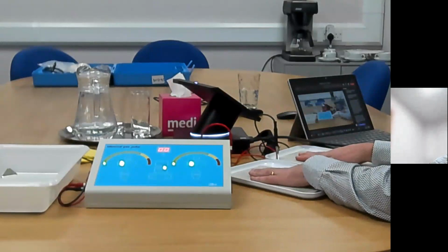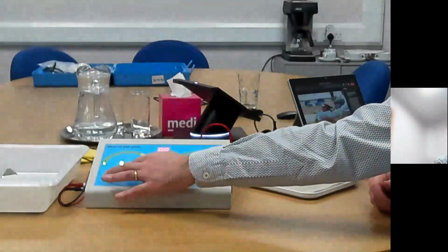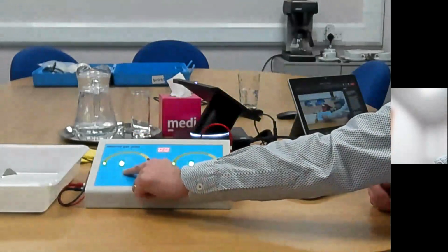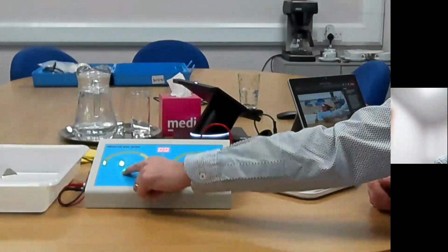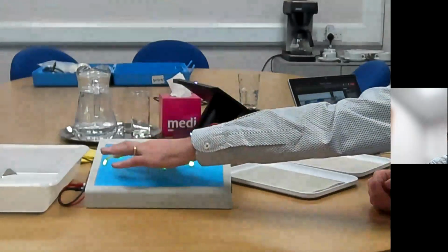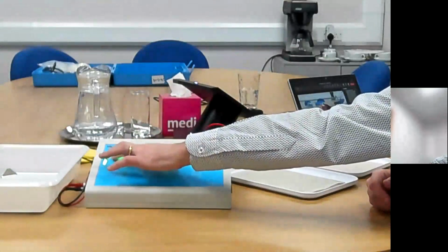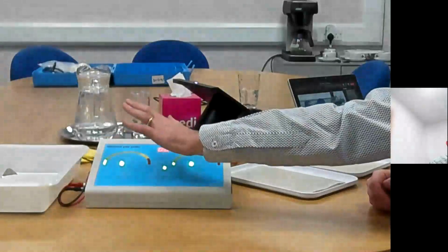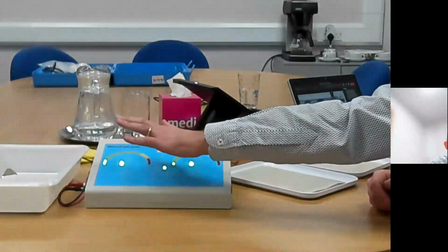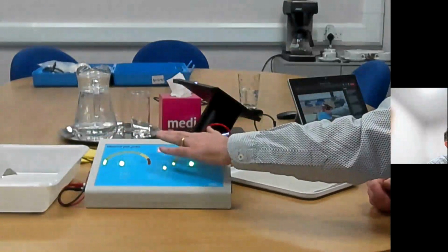So once the patient's comfortable with enough water in the tray, you can then come onto the device. You can use the up arrow there to increase the current until it's comfortable for the patient. When you first start, the patient will probably only tolerate less than 5 milliamps. That's fine, just as long as it's comfortable and it's not hurting them at all. You then progress through the treatment.